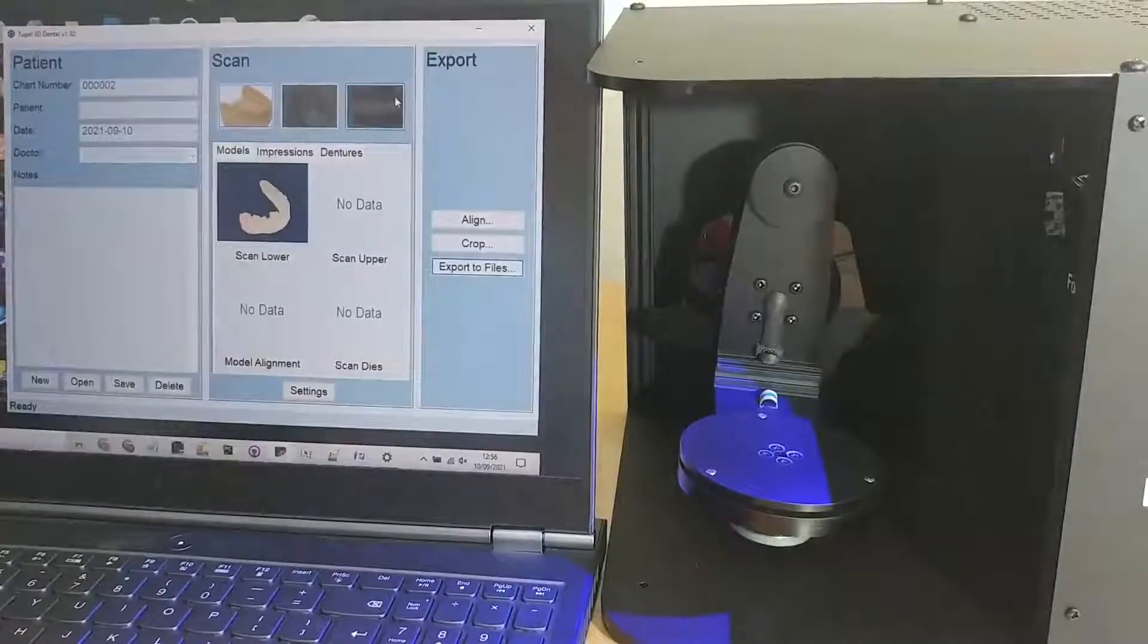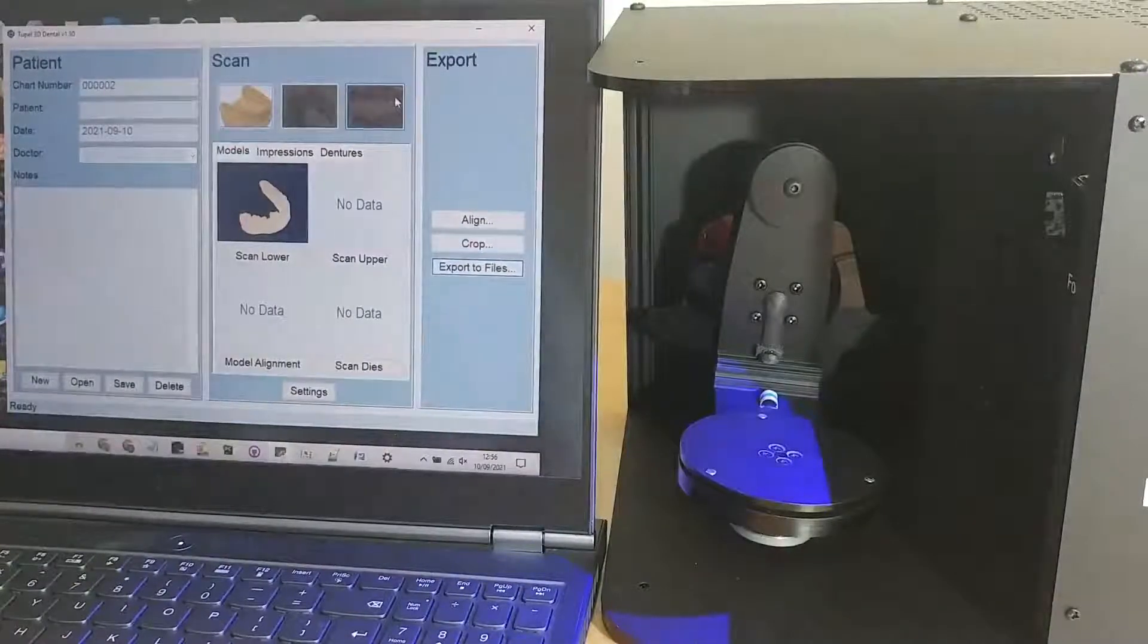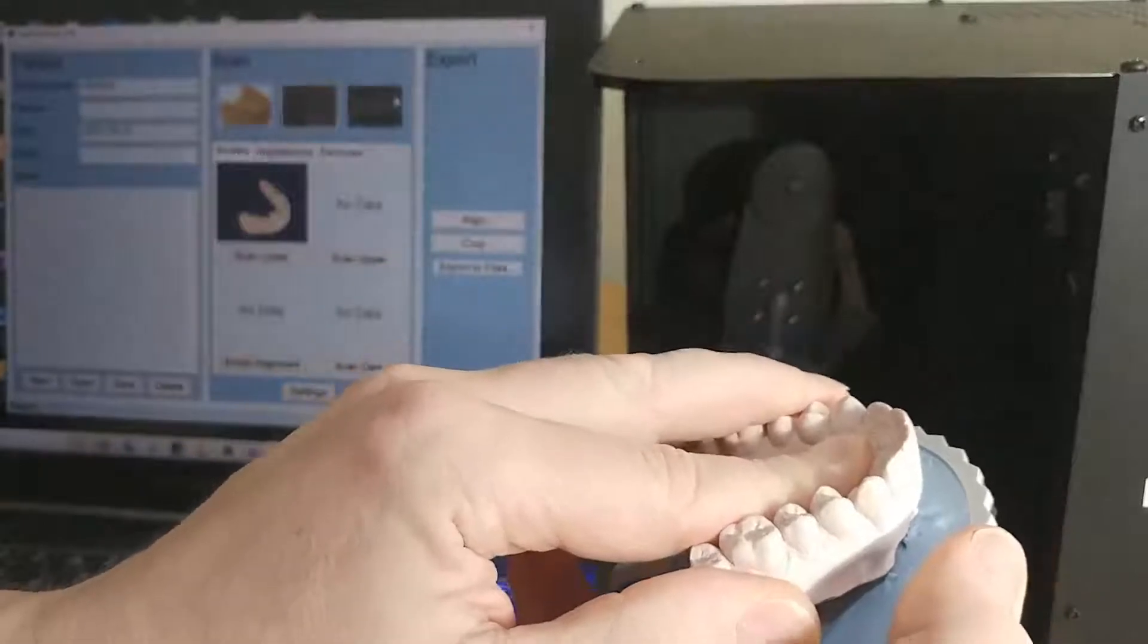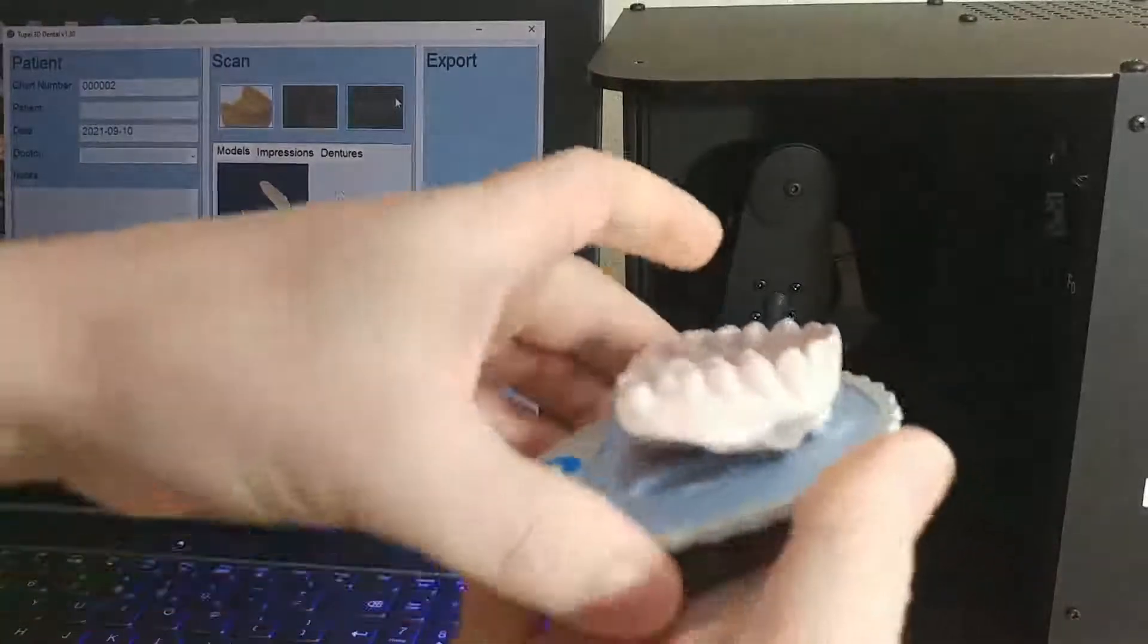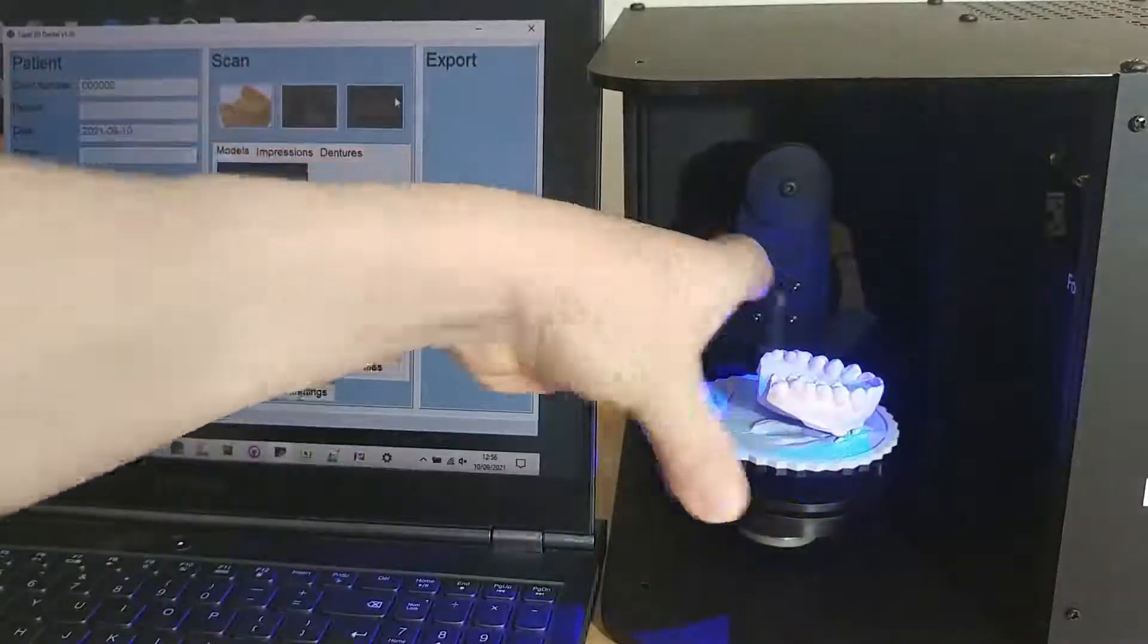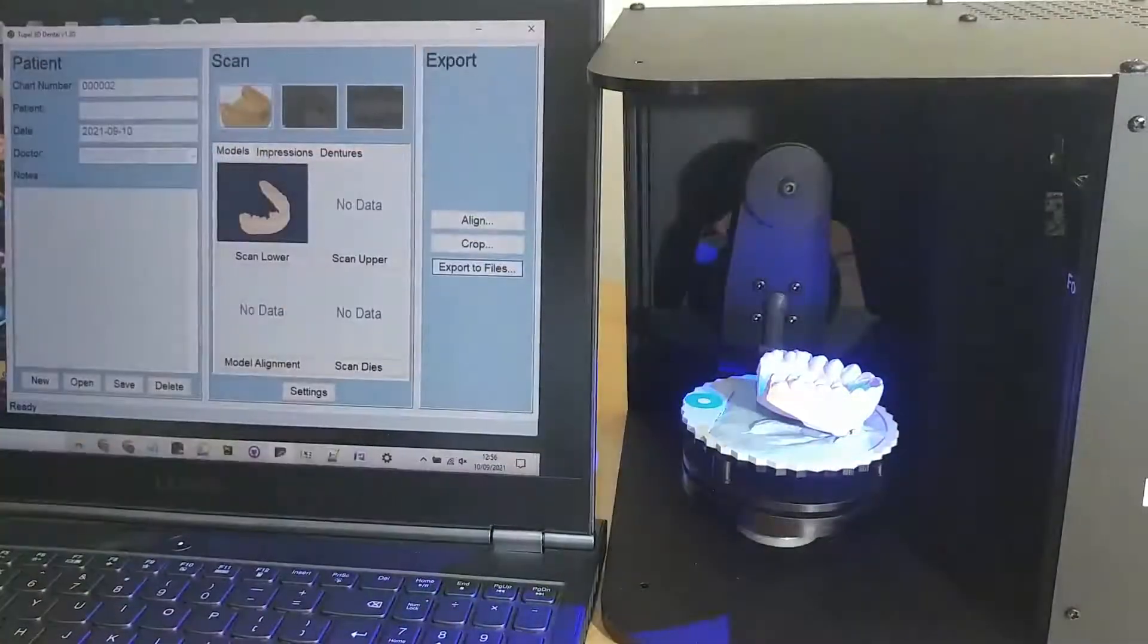The next thing I'll do is scan the upper model from the same patient. So again that goes into the tack pad and onto the scanner and this time we click scan upper to get that into the computer.